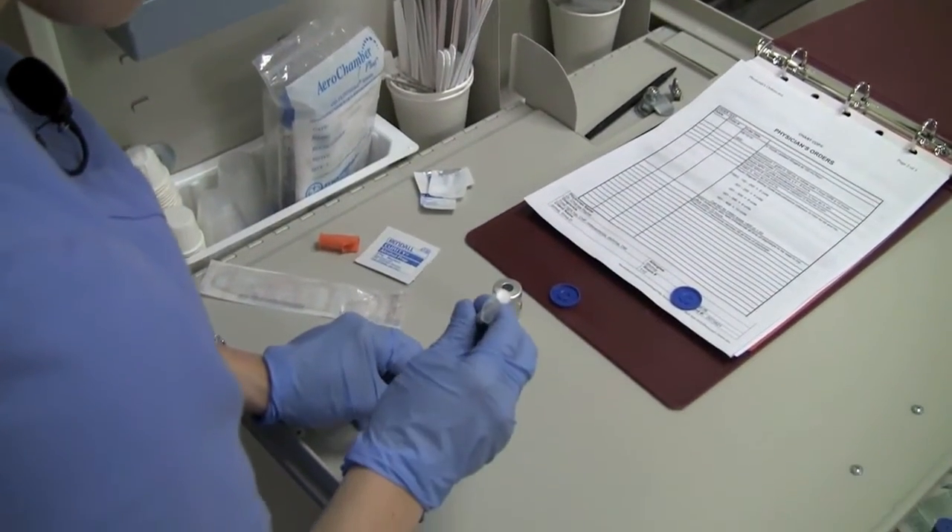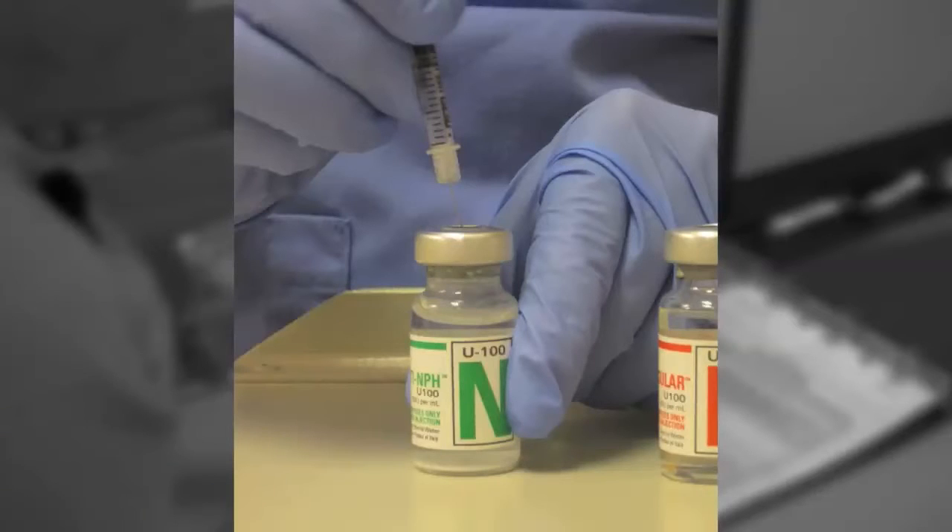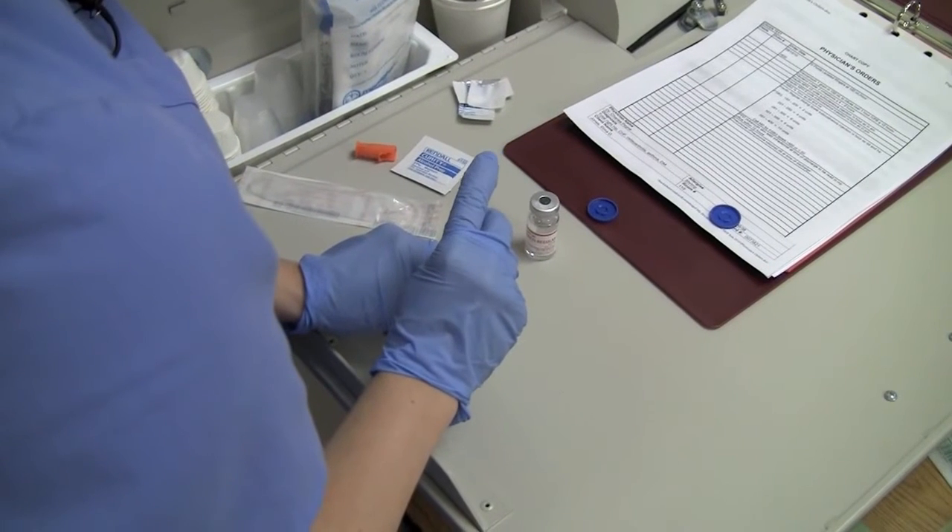With the vial placed on a firm surface, insert the needle into the center of the rubber cap, maintaining sterility. Inject 30 units of air into the NPH vial and withdraw the needle. There should be no insulin in the needle, and the needle should not touch the insulin.